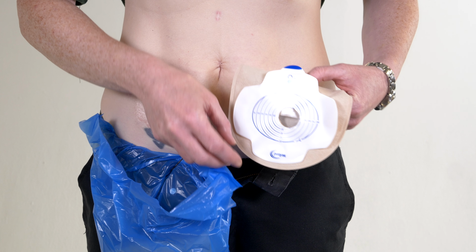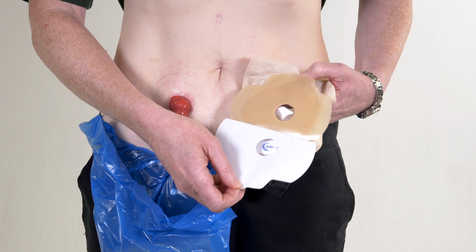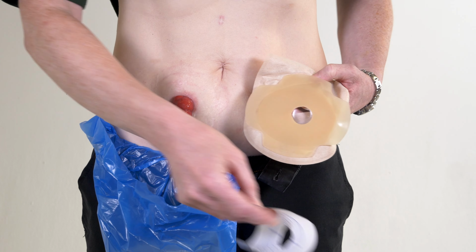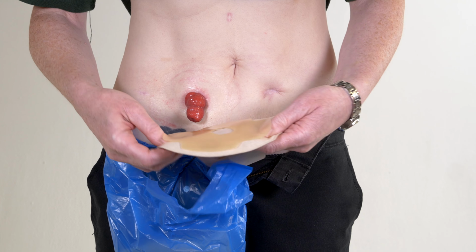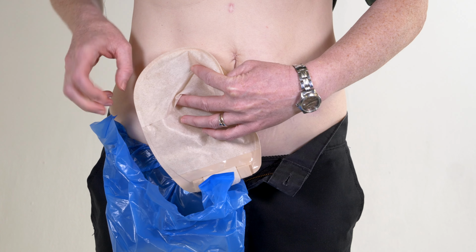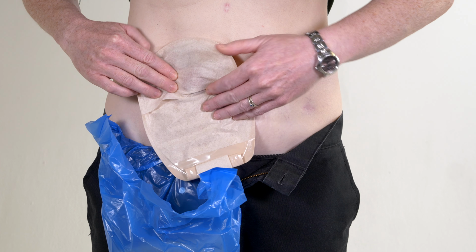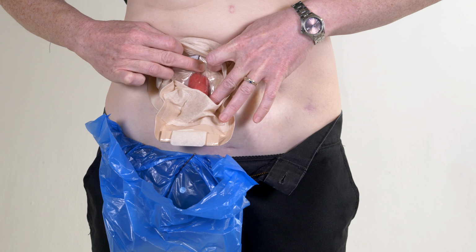Peel the release liner or protective cover away from the adhesive flange of your pouch. Avoid touching the sticky part too much so it adheres well. Carefully line up the opening of the pouch with your stoma. Make sure it's centered to avoid gaps or pressure on the stoma.